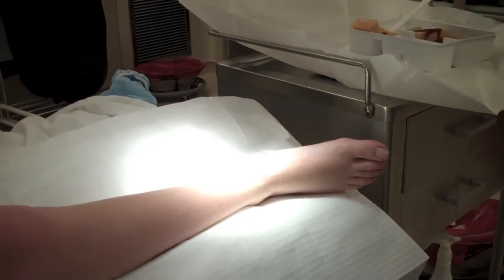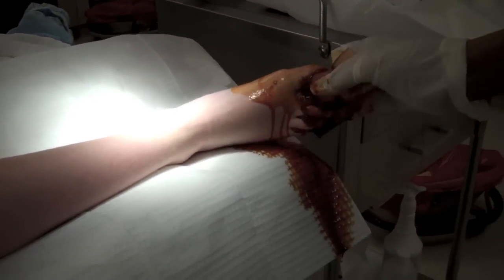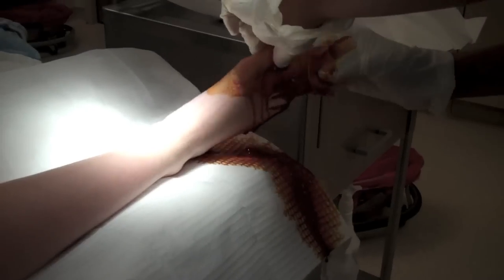Because he's such a little one, I'll start on his toes so I can get those cleaned off, then I can pick his foot up and make a mess. That's okay — a sloppy prep is a good prep.